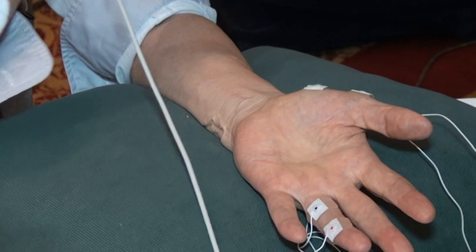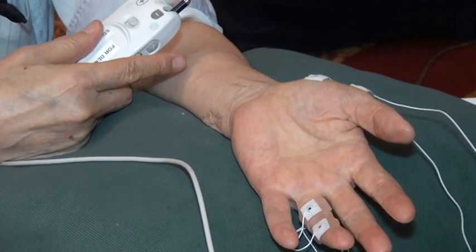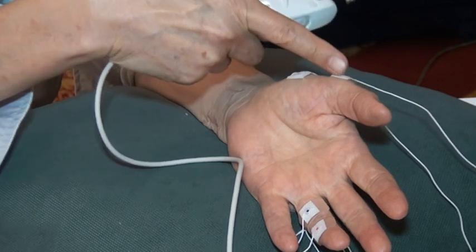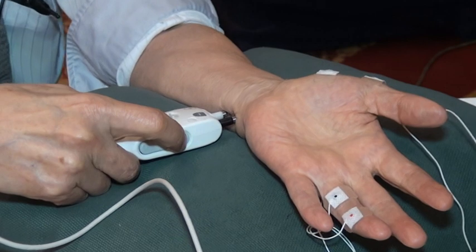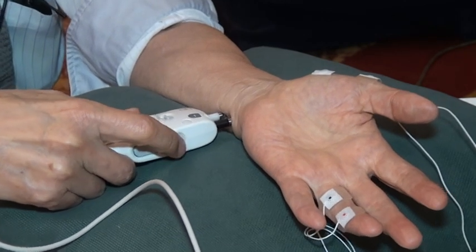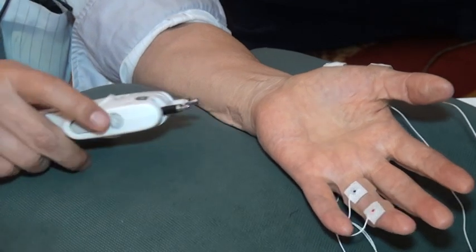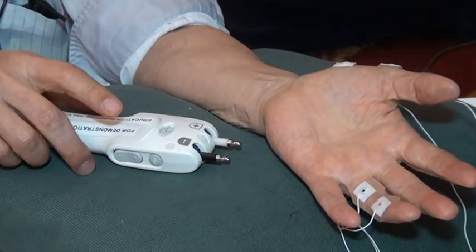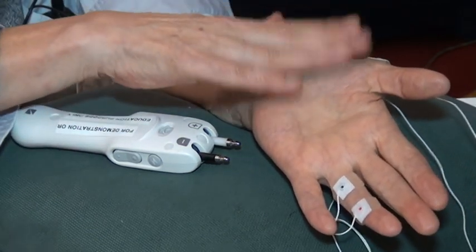But you see the response here. Why do I see the response? I'm on the abductor pollicis brevis. When I stimulate the ulnar nerve, why do I get the response? Volume conduction. From which muscle mainly? Adductor pollicis, which is under the abductor.